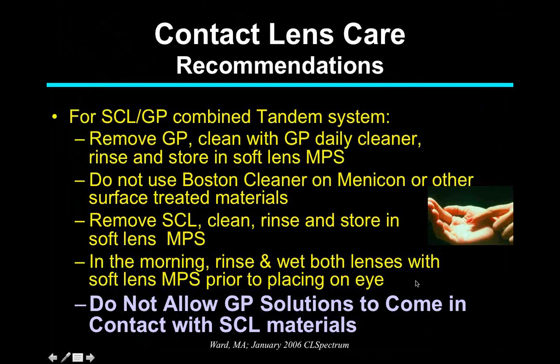But I've got to mention something about lens care. It's really important, if you're going to fit tandem lenses, soft and rigid combinations, that you do not allow the rigid lens cleaner or the rigid lens conditioning solution to come into contact with the soft contact lens, because it will be absorbed like a sponge into the soft lens and will concentrate those preservatives, which are not supposed to be used in conjunction with soft contact lenses, and can then cause a corneal burn from that. So be very, very careful.